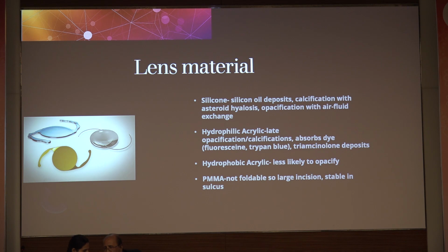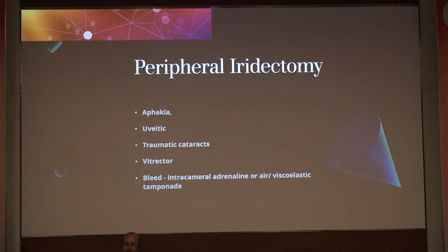The hydrophobic acrylic are the best materials to use. They are less likely to opacify. PMMA lenses are not foldable, so we need to give a large incision, but they are stable in the sulcus, so they can be considered in case of any complications.